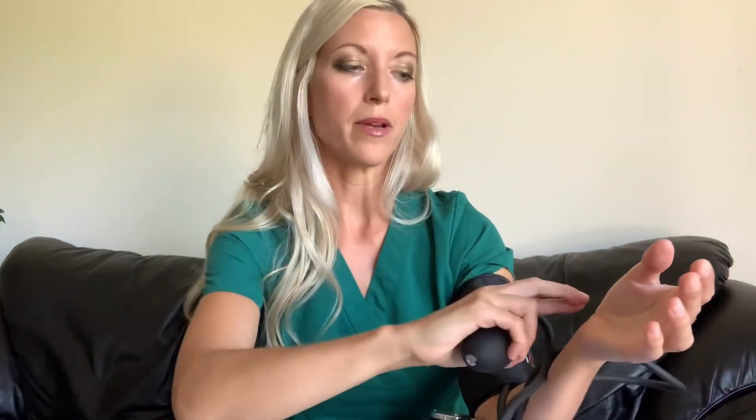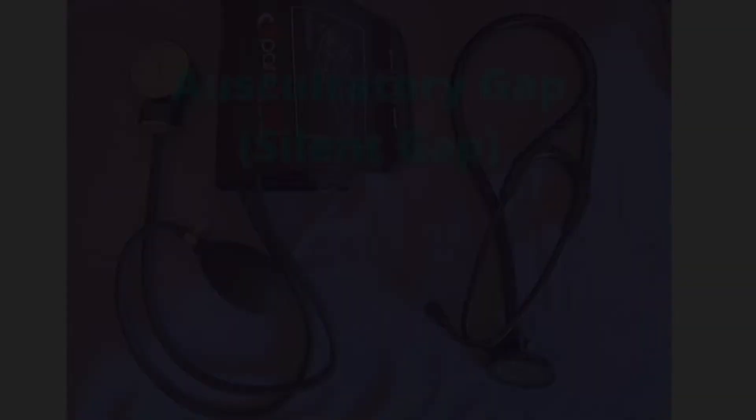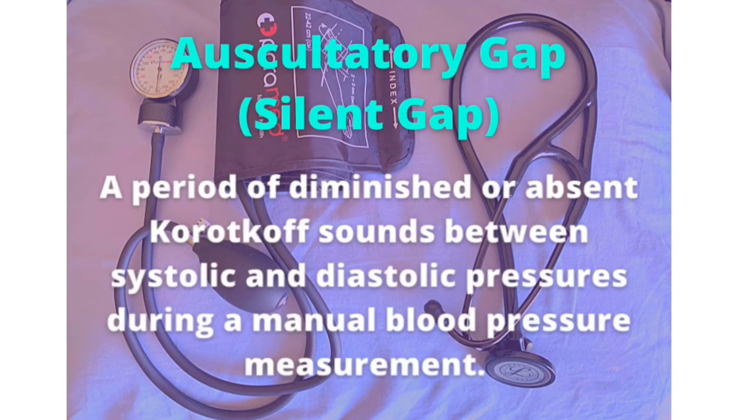Some sources say that if you don't know the systolic blood pressure, you can pump up to 160 to 180 and then start releasing from there. Another way to determine the estimated systolic is to palpate the radial pulse and inflate the cuff until you can no longer feel the pulse. If doing this on yourself, it's easiest to use the opposite arm — palpate the radial pulse with your opposite hand while inflating with your dominant hand, with the gauge visible. The purpose of estimating systolic pressure is to avoid discomfort from over-inflating the cuff, and it also helps detect an auscultatory gap — a period of diminished or absent Korotkoff sounds between the systolic and diastolic pressures — which is more often detected in elderly patients.